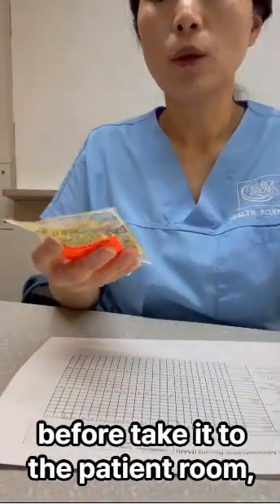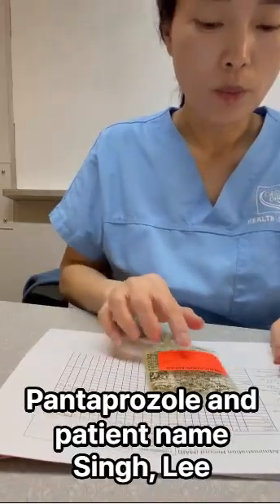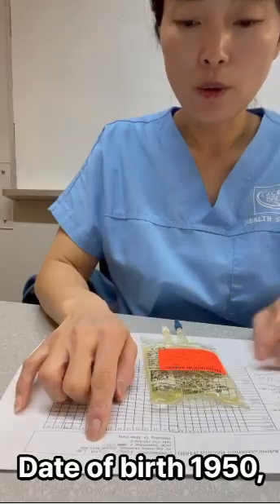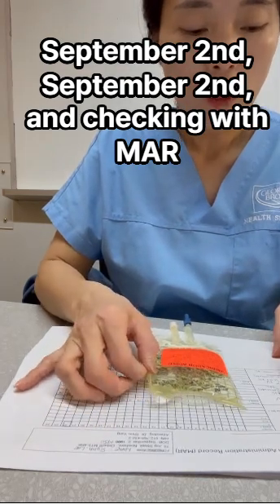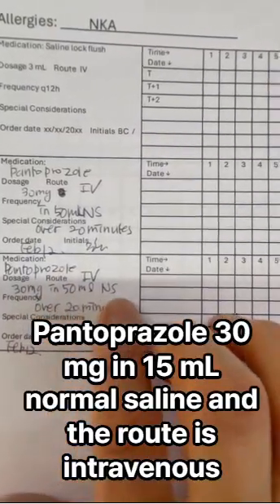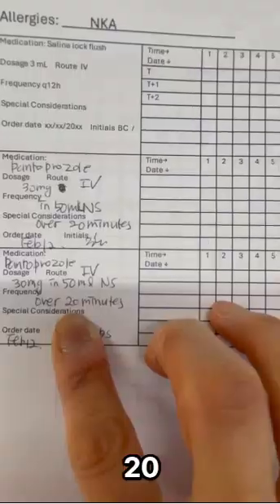Before I take it to the patient room, I'm gonna double check with the MAR. Pantoprazole, and patient name Sin Lee, date of birth September 2nd, 1950, and pantoprazole 30 milligram in 50 milliliter normal saline, and route is intravenously, and the time over 20 minutes.